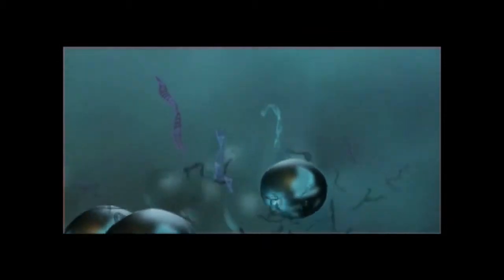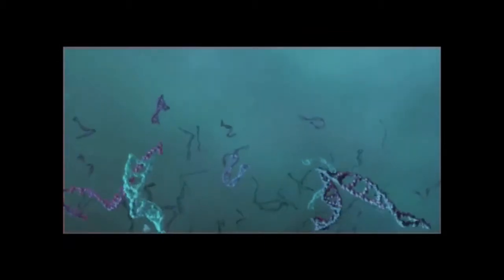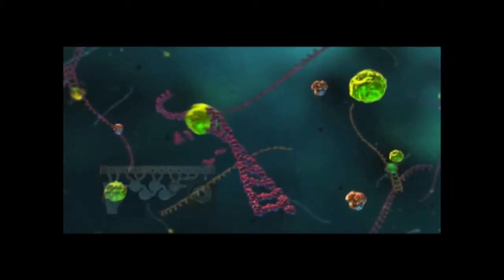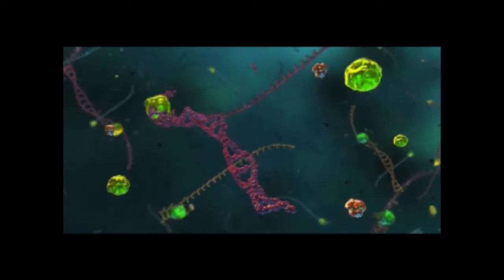Next, an elution buffer releases the purified nucleic acids from the magnetic beads. The magnetic beads are again magnetically secured while the nucleic acids are moved to the first stage PCR chamber. A reverse transcription step is performed to convert any target RNA into DNA.